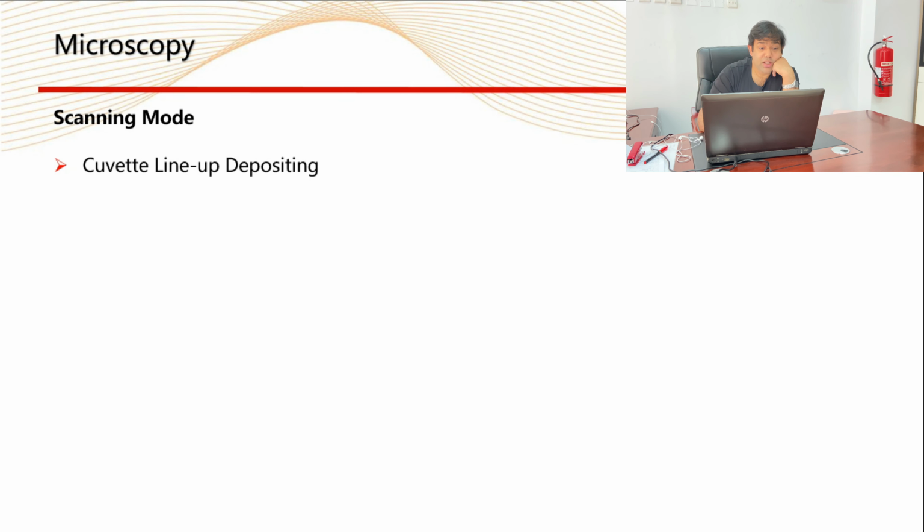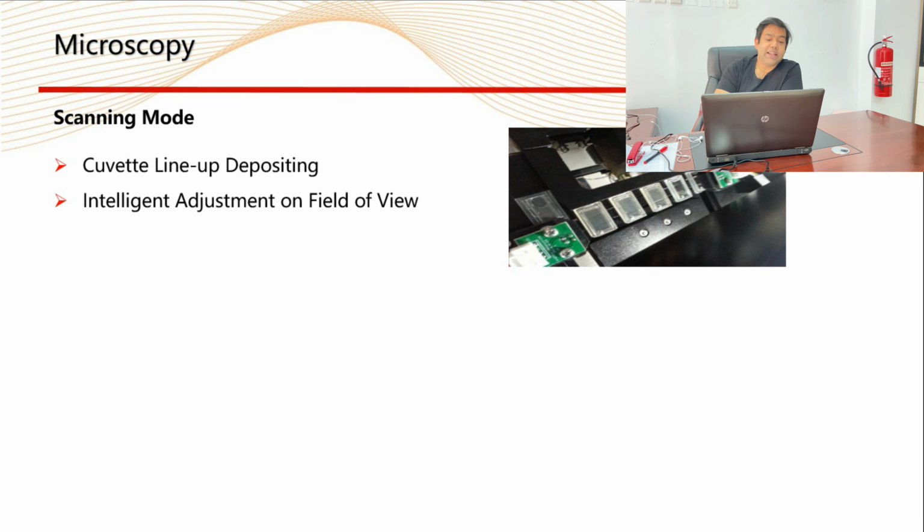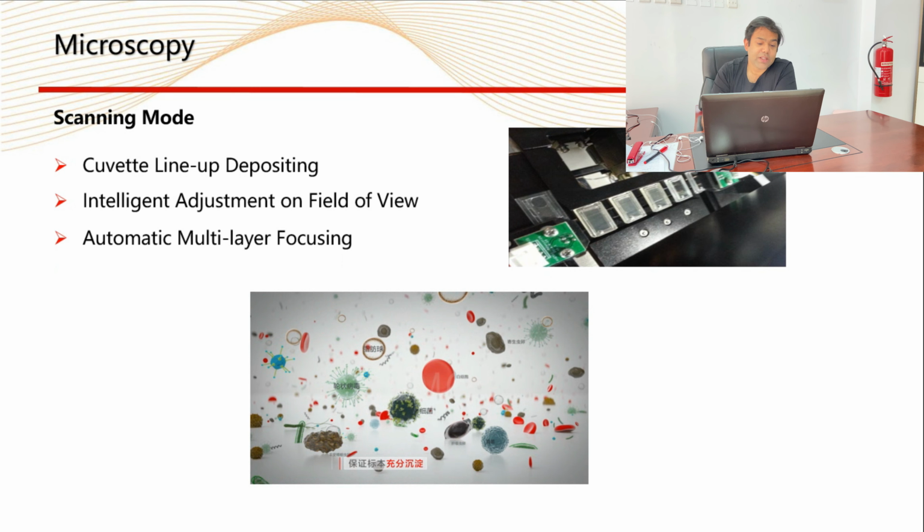And scanning mode, and here I'll show you the cuvette lineup depositing like this, in that way. Intelligent adjustment on field of view, automatic multi-layer focusing. So just look at this image. It will not show you particle wise, it will show you full field view. Same like which I showed you in my last video in the urine sedimentation analyzer by Tonica.